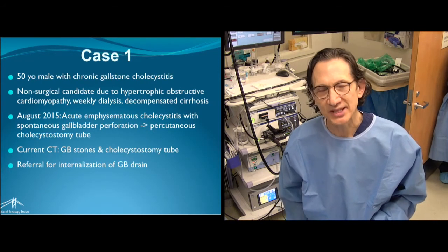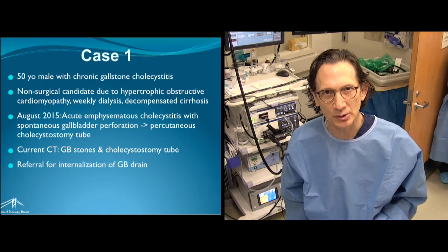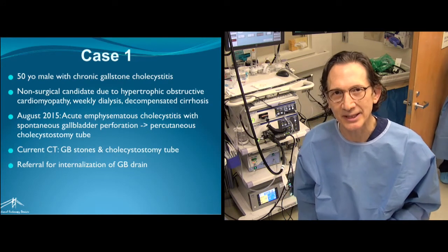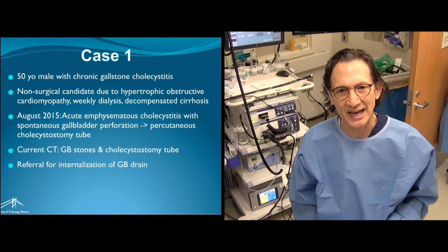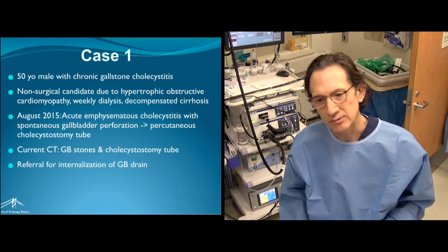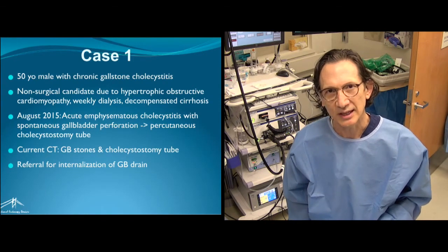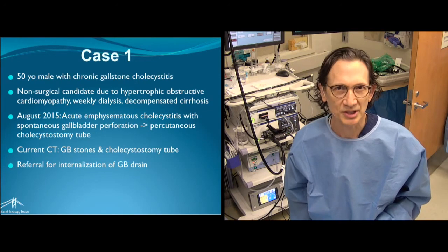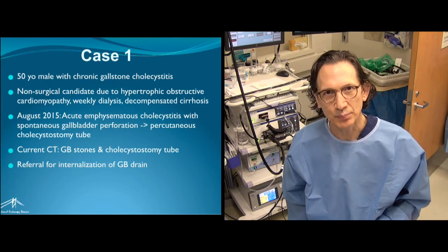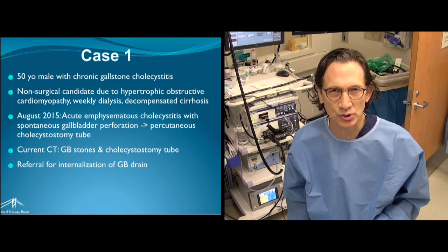We're going to switch topics now. I just enjoyed some of the discussion about full thickness closure of defects and removal of submucosal tumors. Very exciting area. We're also very excited about that, and perhaps at a future date we'll be able to show you some of the things we're doing. But we're going to switch to the topic of management of the patient with acute gallstone cholecystitis, and particularly the poor surgical candidate. This patient today is actually a non-surgical candidate.